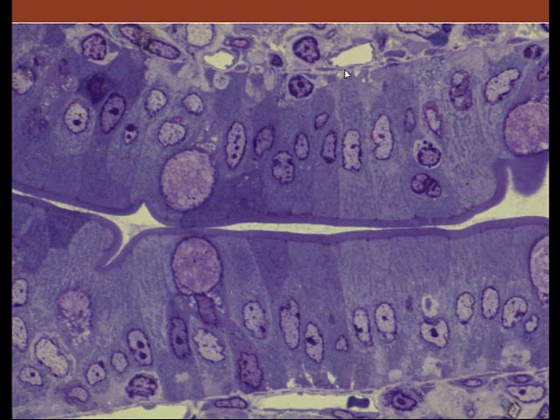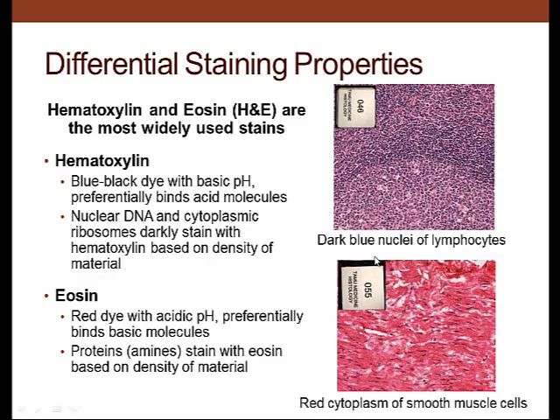And so epithelial versus endothelial, and these are lymphocytes. And this is the nucleus with the heterochromatin on the outside and the euchromatin on the inside. These are goblet cells in through here. So these are the nuclei of the intestinal absorptive cell, and here are the cytoplasms of these different cells, which have the various components that we just saw a while ago.